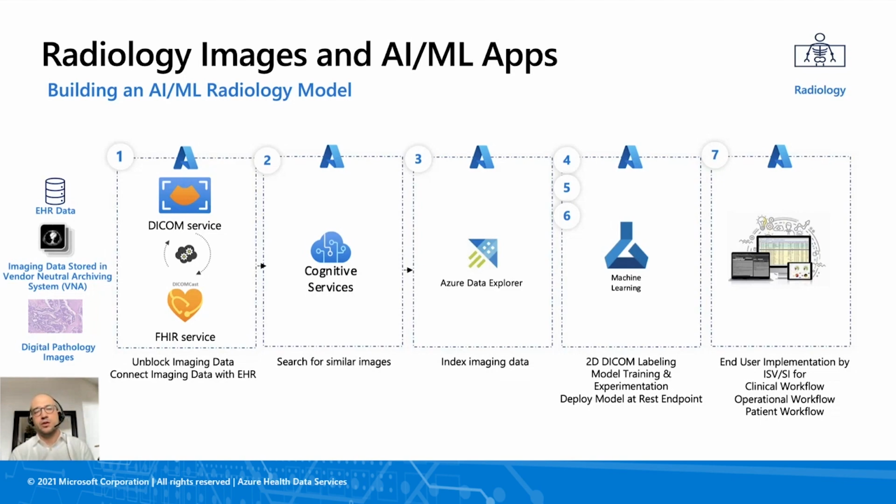For example, you are coming up with 20,000 brain tumor images, which have a similar tumor size and a similar location. And what you will do next is use Azure Data Explorer to slice and dice the data to come up with your search parameters. So you can say that you have 20,000 images which have similar tumor size and location.